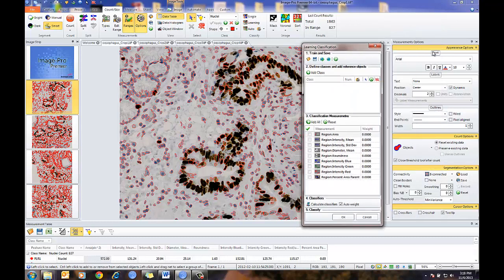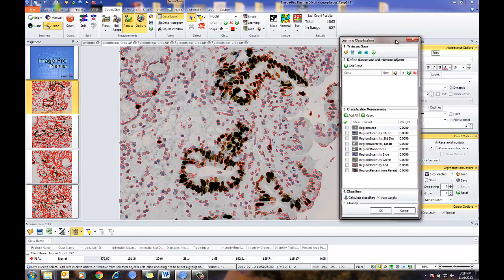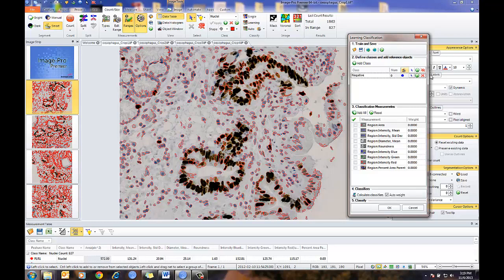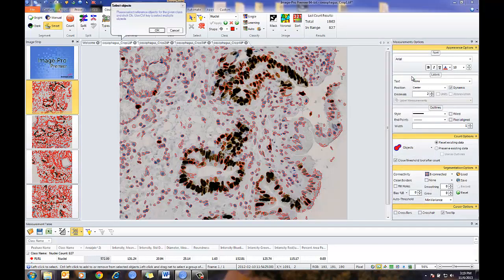I've also brought up my measurement options, because this will be a very nice way of seeing and color-coding my nuclei. I'm going to add a class — you'll notice it gives a class name, the number of objects, the color, and a pointer for selecting my reference objects and building that grouping. I can reset and delete any class. I'm going to name the first class Negative. It'll be outlined in blue. I'll simply select my Selection tool, and it gives me a prompt for selecting my nuclei.